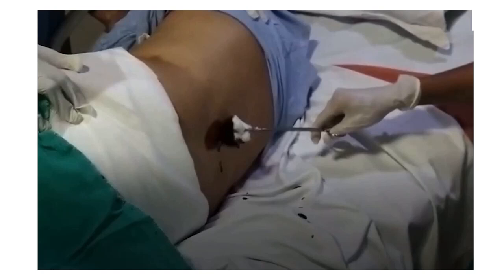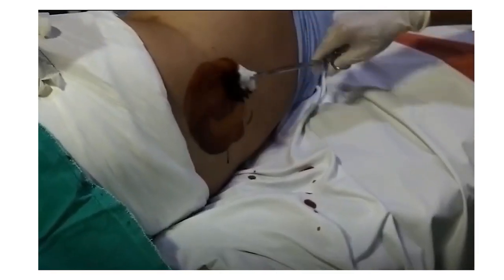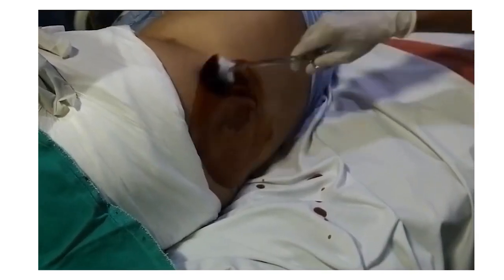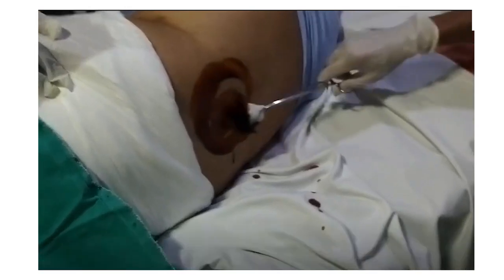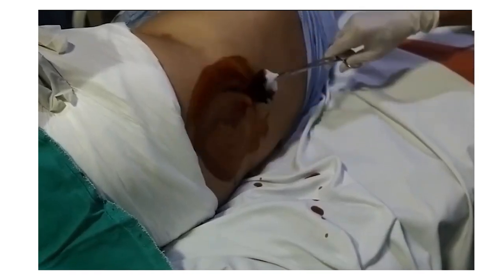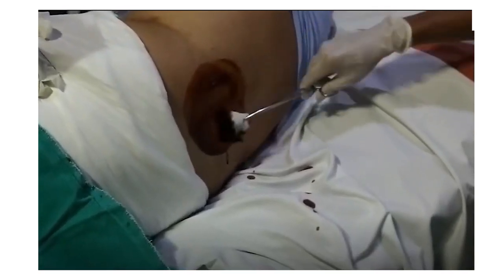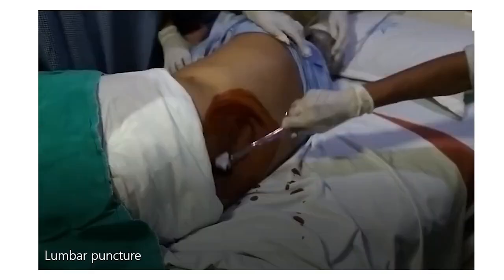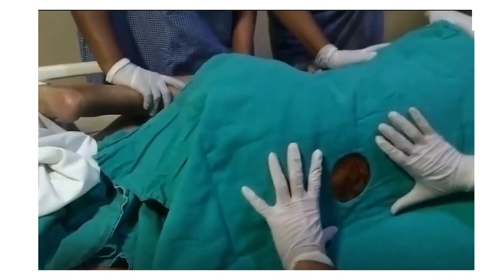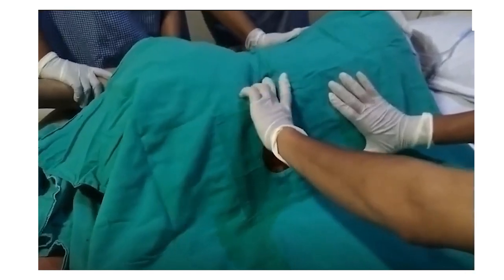Position the patient in the lateral recumbent position. Use skin swabs and antiseptic solution to clean the skin in a circular fashion starting at L3, L4, and then include the interspace above and the one below it as well. Before application, warn the patient that the solution is cold, because especially in a cold winter, this cold antiseptic solution in some patients can be really unnerving. Once done, you are going to use a sterile fenestrated drape that is deployed on the patient, and you can recheck the site where you will be giving local anesthesia to the patient.